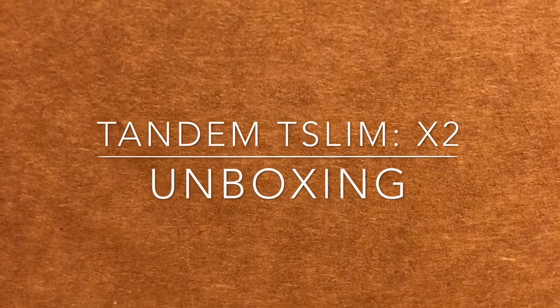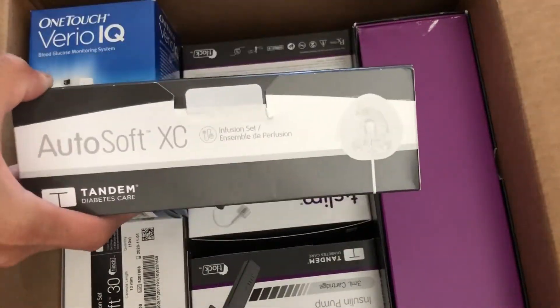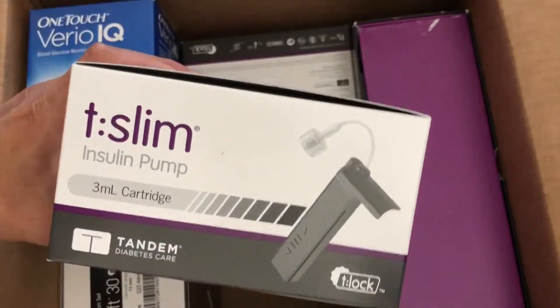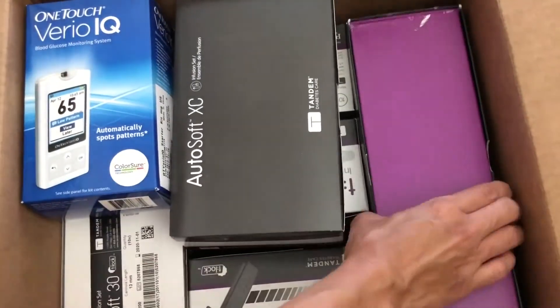The Tandem t:slim X2 comes with the variometer infusion sets. I have the Autosoft XC, although I'm probably gonna exchange them for the 90 and the steel sets. It also comes with insulin cartridges and the actual pump itself.